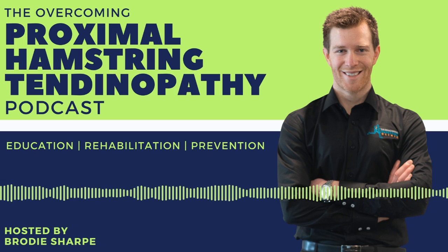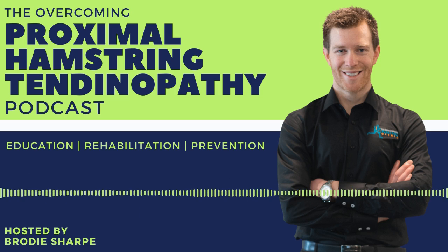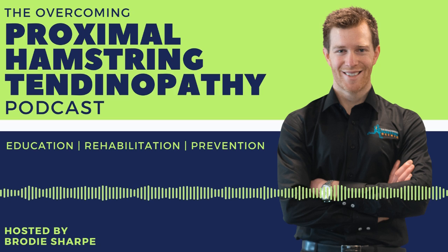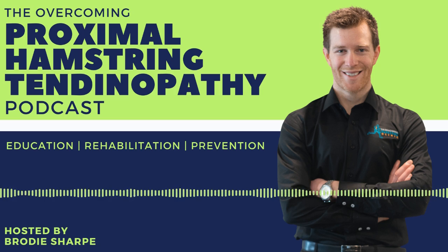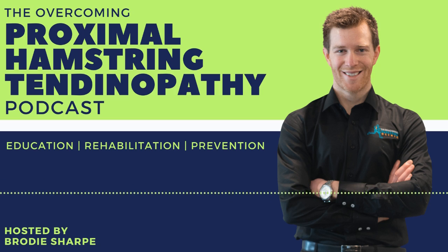The last thing you want to do is, if a patient comes to me with pain 9 out of 10, they're really struggling. So I say to them, you're paying me to give you more pain. If you're 9 out of 10, after Shockwave, it'll be 12 out of 10. Why do you want that? So let's bring you down to, and sometimes just the rehab might be enough. So a lot of patients, I might start them on rehabilitation just to get them back, and they don't need Shockwave to go forward.